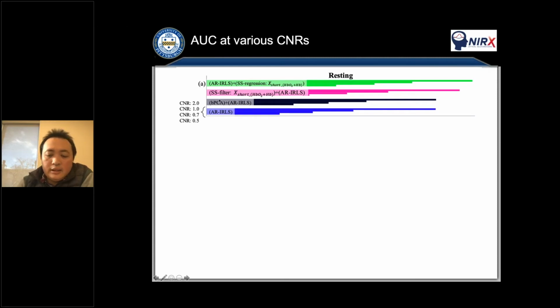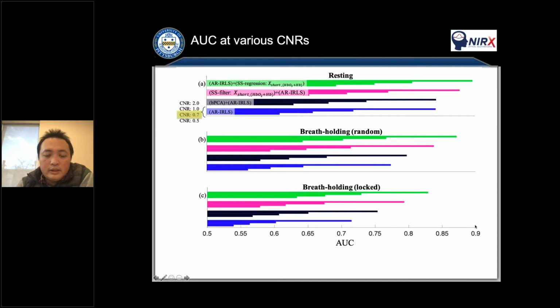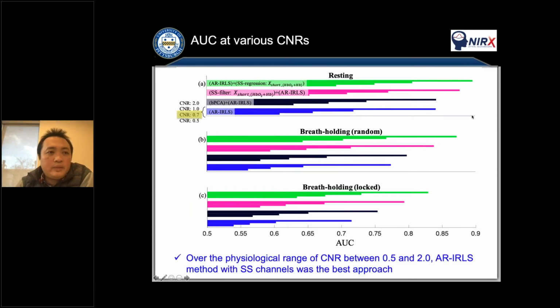So you can see this is for 0.7. Autoregressive with short separation regression is still the good one, but it seems like beyond 2, this is the AUC, it will be saturated, AUC equal to 1. So the conclusion for this one is over the physiological range of between 0.5 and 2, autoregressive with the short separation channel was the best approach.